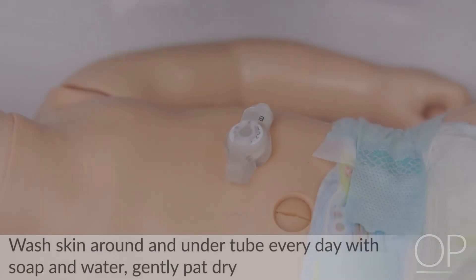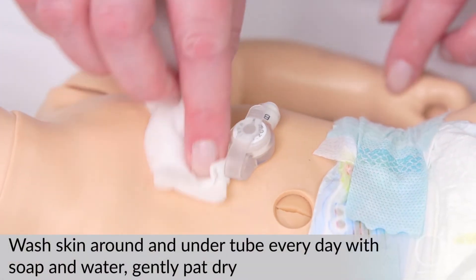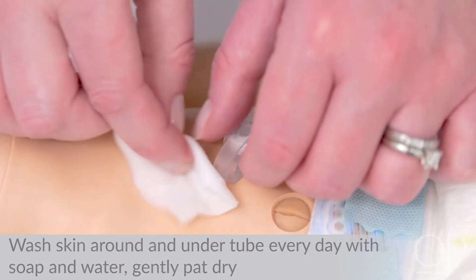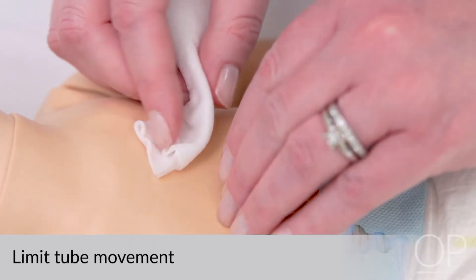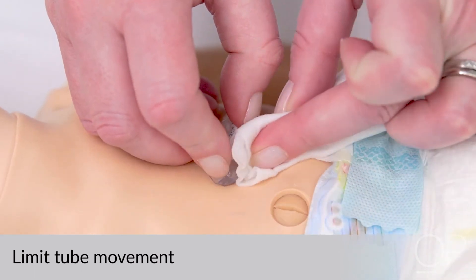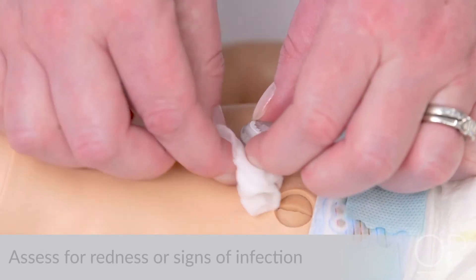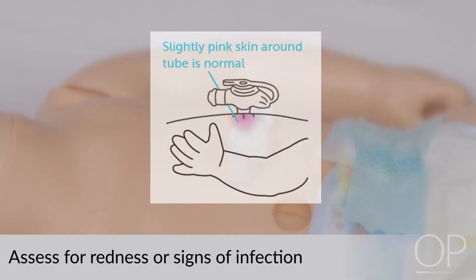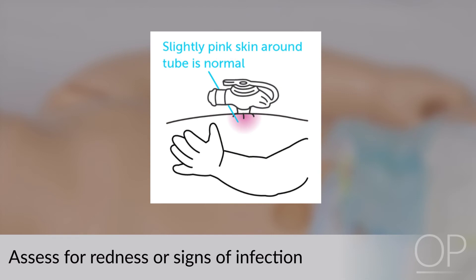To clean the G-tube site, wash the skin around and under the tube each day with soap and water and gently pat dry. Try not to move the tube around too much because the opening may become stretched, causing stomach juices to leak out and irritate the skin. While cleaning the site, assess for redness or signs of infection. The area around the G-tube may be a little pink — this is normal.